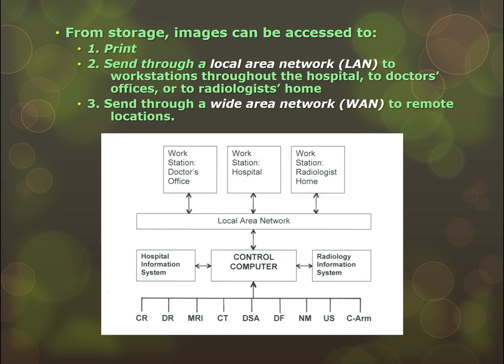It may go a little bit outside to a radiologist's workstation set up at home, but it's a part of a network that is local to the building, the local area. It may go to home. It's probably within one county if you want to think of it in geographic terms.